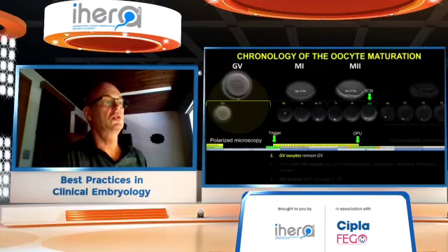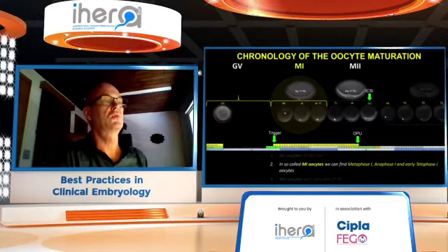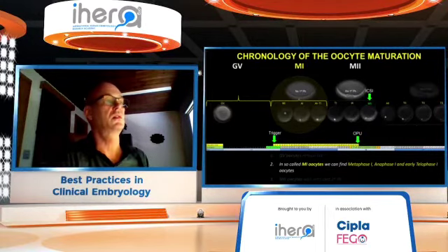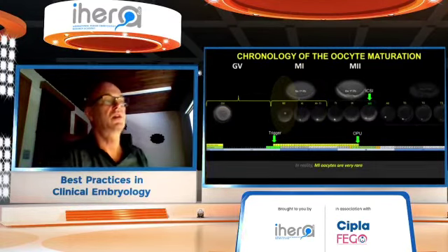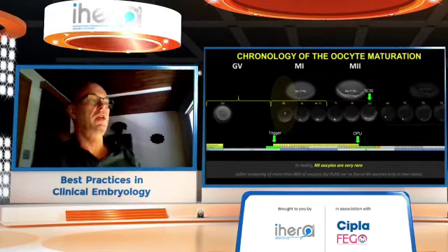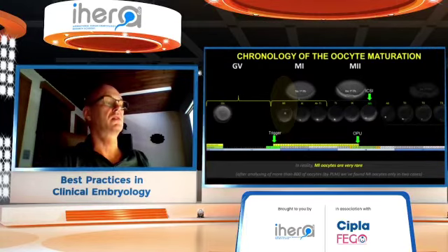While GV remains GV, in so-called metaphase 1 oocytes without a visible first polar body, we can find metaphase, anaphase, and early telophase oocytes. And in reality, metaphase 1 oocytes are very, very rare. After analyzing more than 800 oocytes, we found M1 oocytes only in 2 cases.